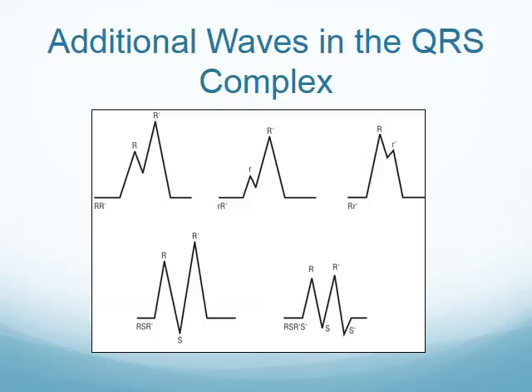Picking up where we left off, we're talking about the QRS complexes. I mentioned in the last slide, the QRS complex is kind of a misnomer. Most of the QRS complexes that you see on your standard EKG in a healthy patient don't typically have each of those waves, as the name QRS complex suggests. The reason for that, we'll get into in more detail on this next slide, and it'll explain why a little better.